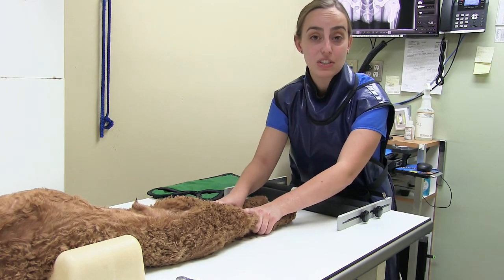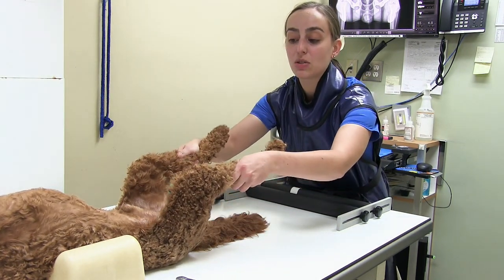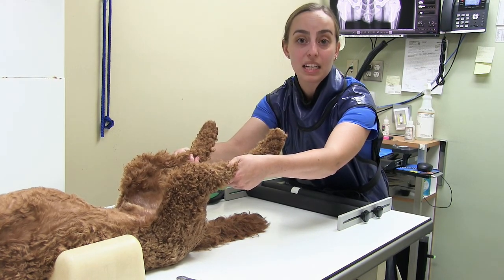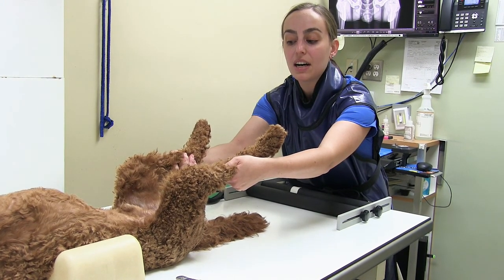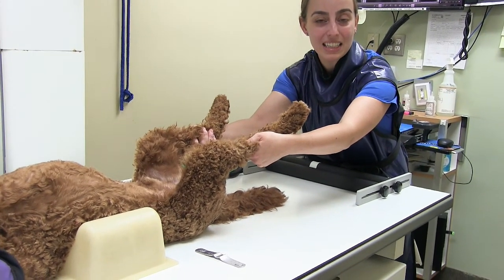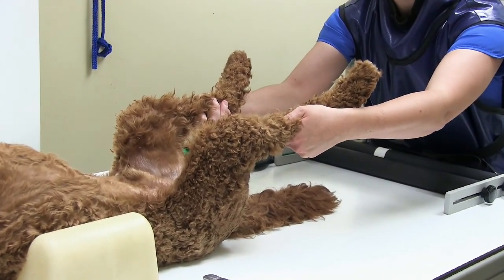Where PennHIP differs is that it has two additional shots. The next two shots are looking at how the hips conform in the hip socket. We basically try to put those hips in that socket as much as we can in the next shot for comparison purposes — what does it look like in a normal position?